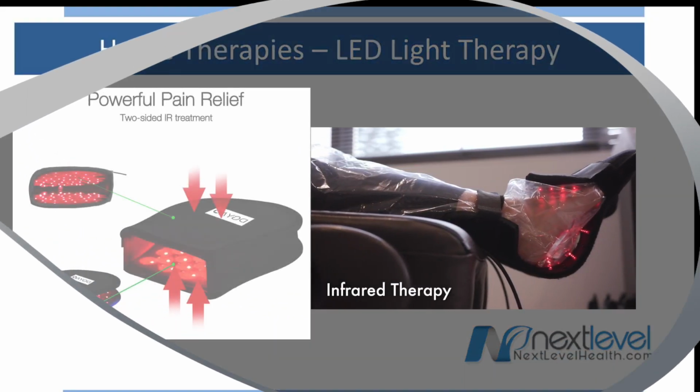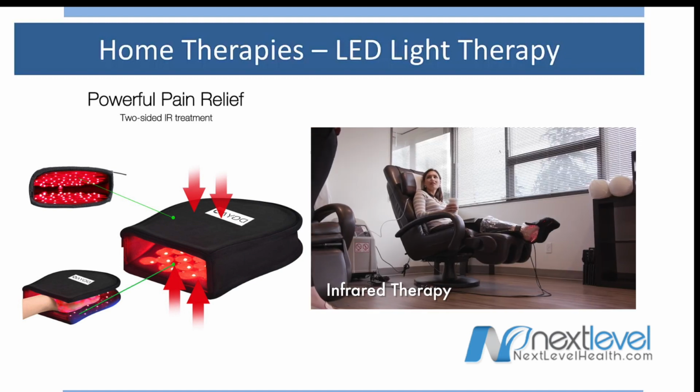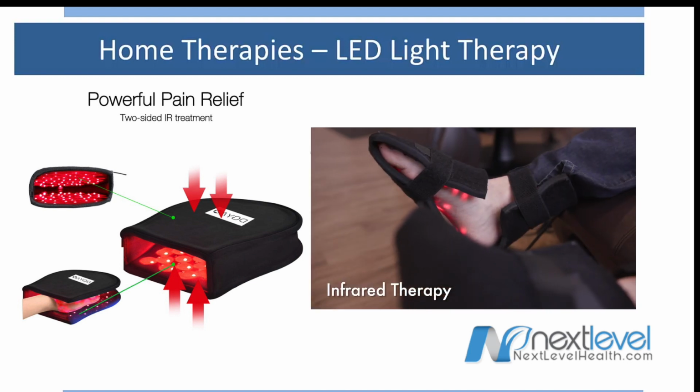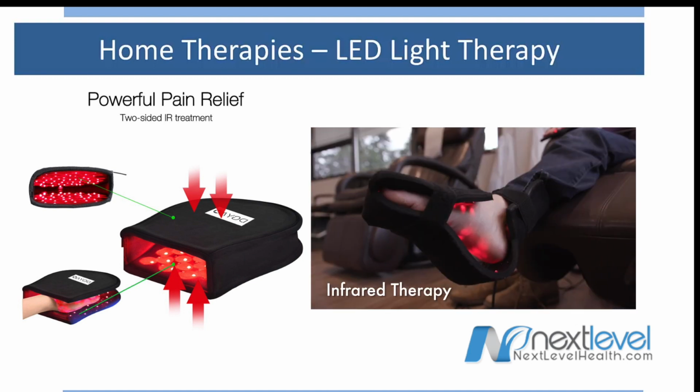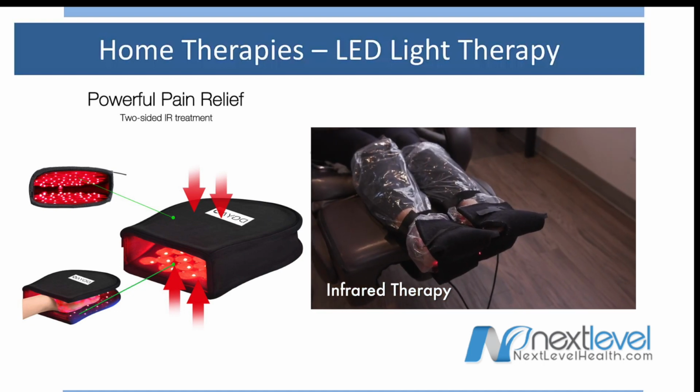The instructions for how you're going to use the light therapy that we are going to give to you. You're going to use it for your hands or your feet. If you have a foot problem only, then obviously only on your foot. If you have a hand problem, only on your hand. Or if we're working with both of those areas, you'll use it on both.